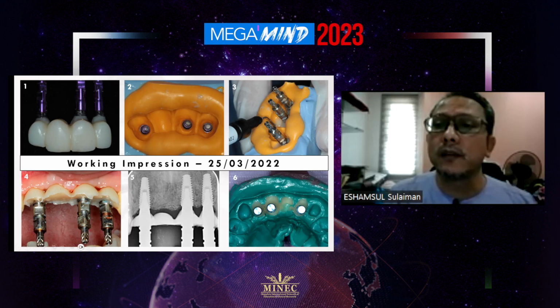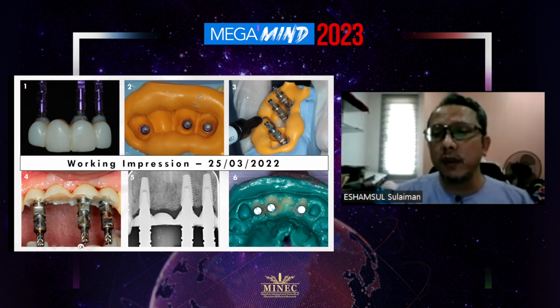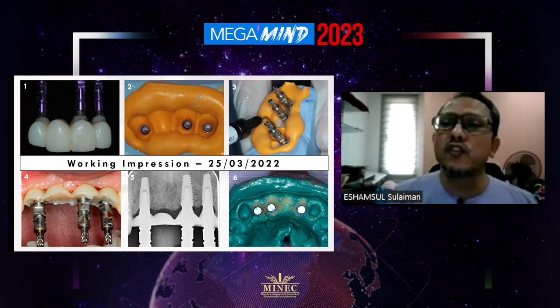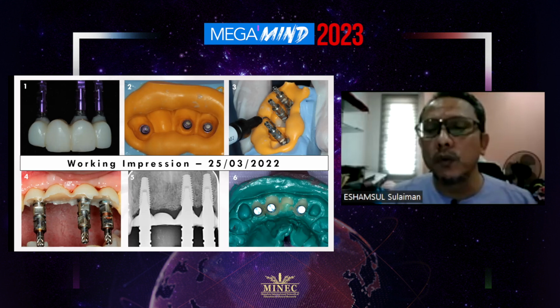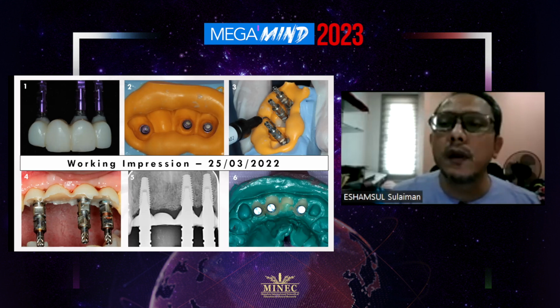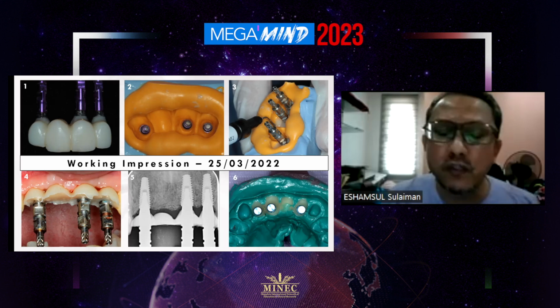And following that, the impression coping at slide number 3 was connected to the analog, and gradually the flowable composite was injected in incremental manners and light cured to prevent volumetric shrinkage.